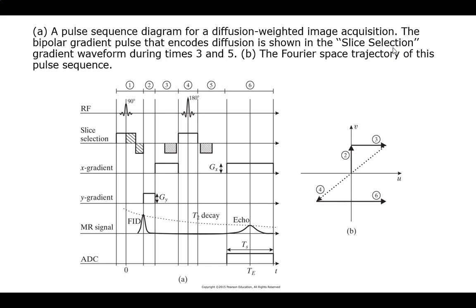And then everything comes back together for my echo, X encoding, and readout. All right. Really, the whole difference between this and the previous one is going to be here. And to be very, very careful, we're doing one at a time. That's pretty much the whole thing.